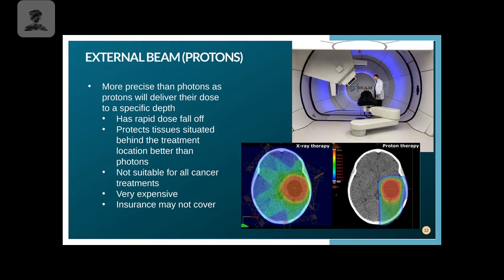But this doesn't work for every single treatment. There's a lot of different cancers out there that they can't do this with, especially because the dose before the tumor is going to be greater than what we would have seen in external beam, just regular photons. But what's behind it could be much more protected. So it really depends on the person, their cancer, their whole setup. It is very expensive, and it's a little bit more rare.